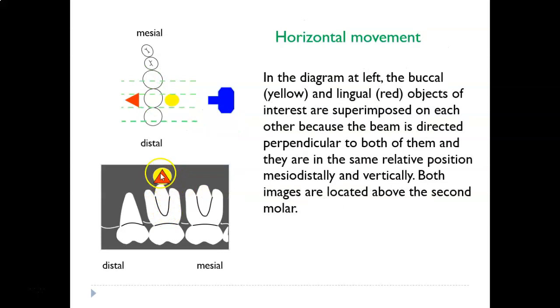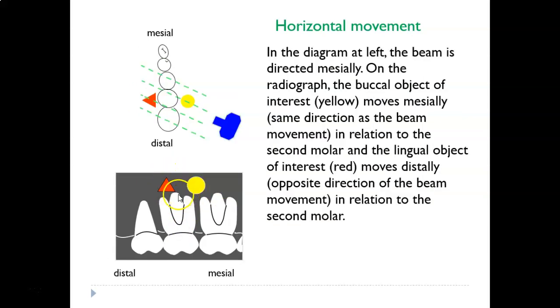So then we can all of a sudden go, oh, I see the difference. This is my first film. They're in front of each other. This is my second one. And because I know where I put my BID, now I know this is buccal and this is lingual.